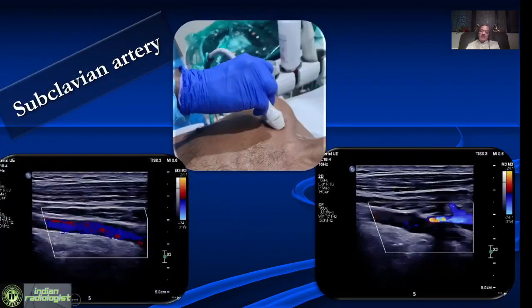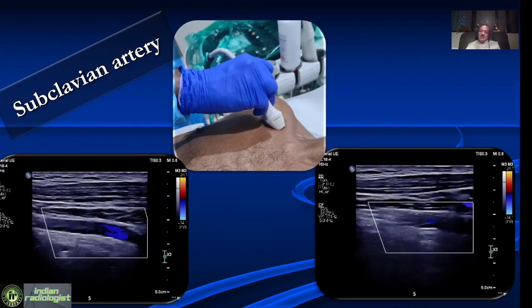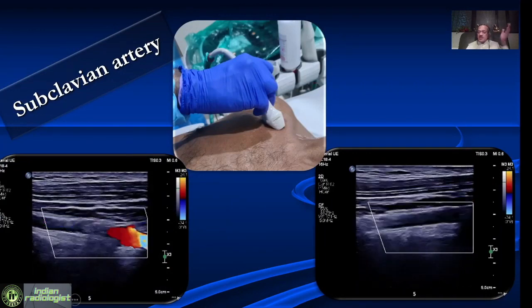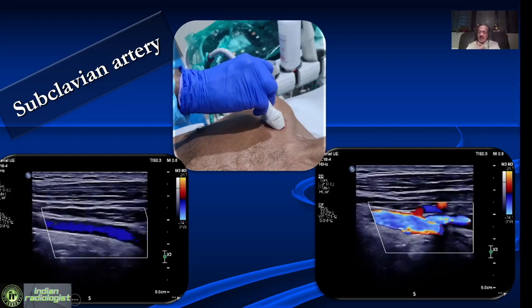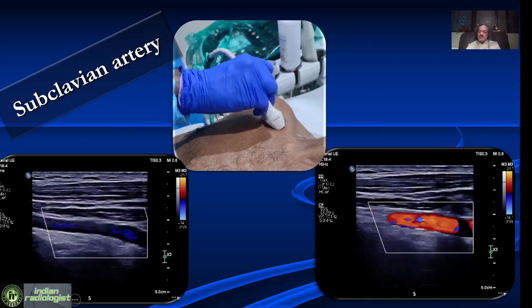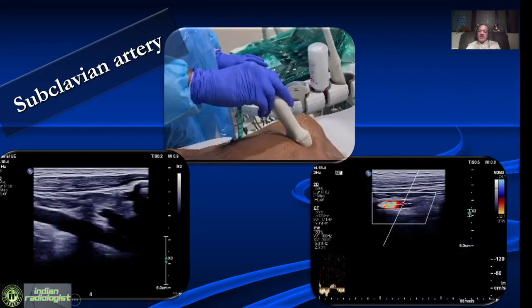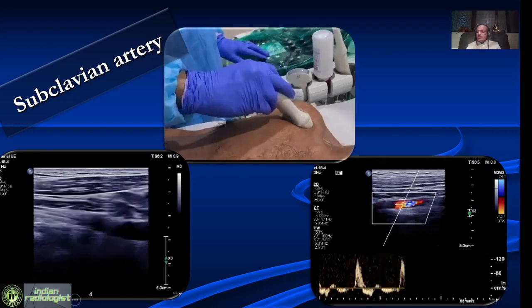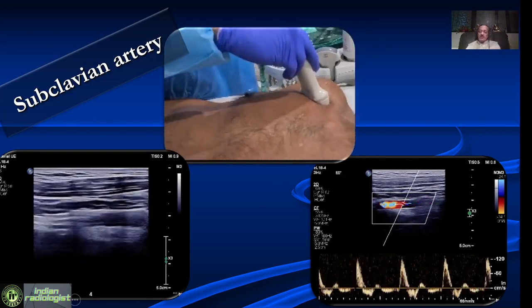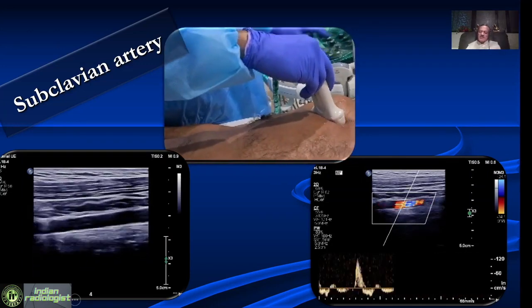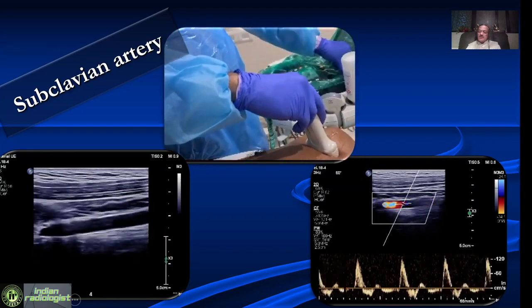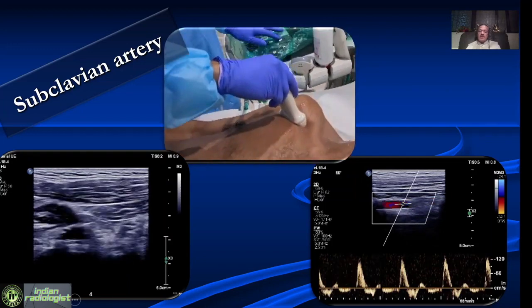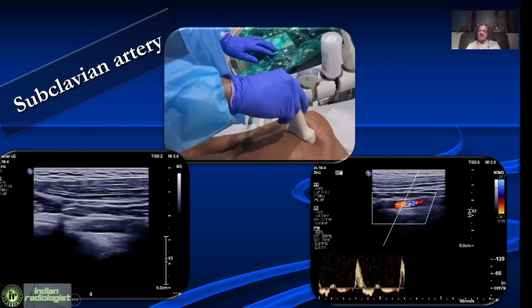Then, keeping the position the same, we look at the subclavian artery. We try to go as close to the origin as possible and tilt the beam towards the manubrium sternum in the proximal portion. As we go distally towards the axilla, we tilt the probe on the opposite side. The subclavian artery typically has a very high resistance waveform with reversal of diastolic flow and a little forward flow later.